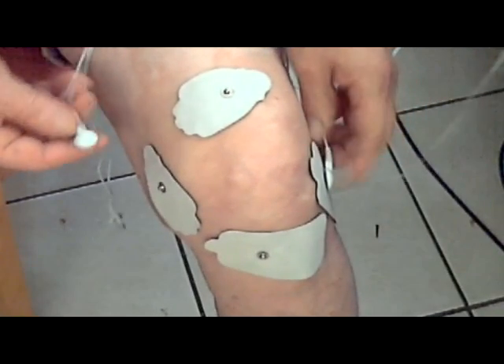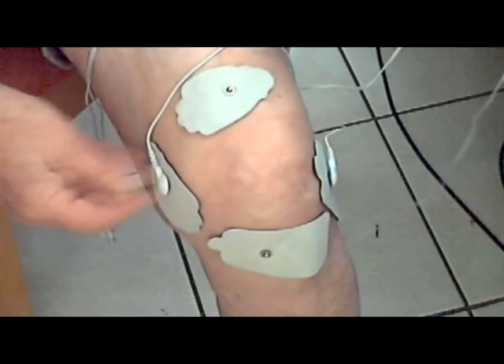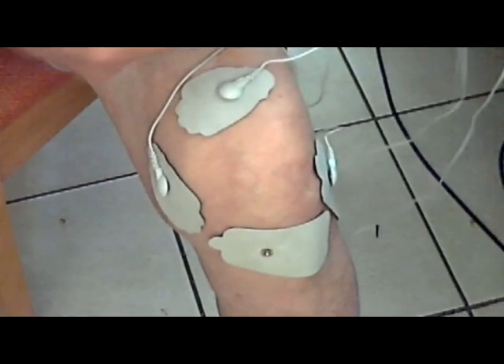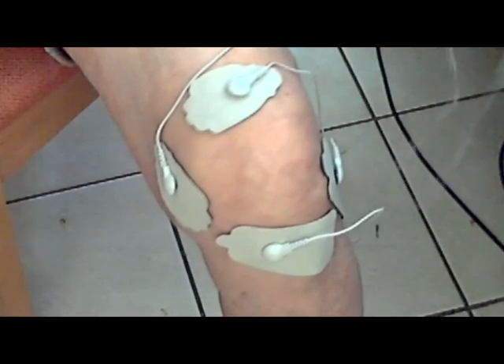Notice how the current flow will be across the pained area, both horizontally and vertically. I'd suggest using a pulse frequency of 80 Hz or less, and a pulse duration or width of about 200 microseconds.